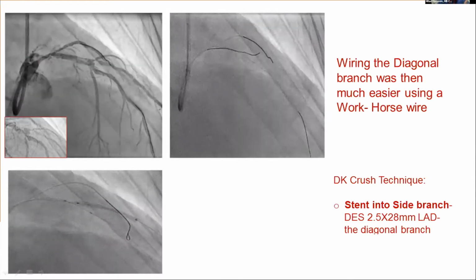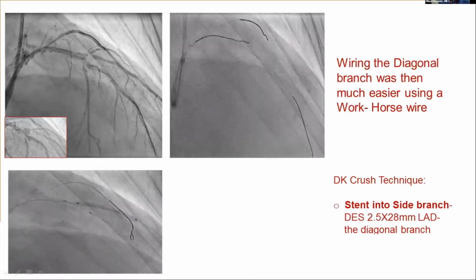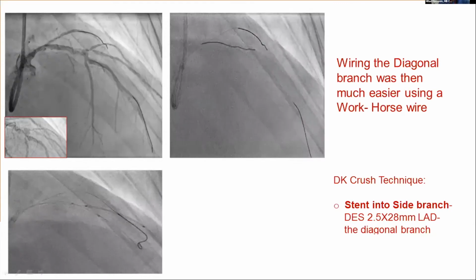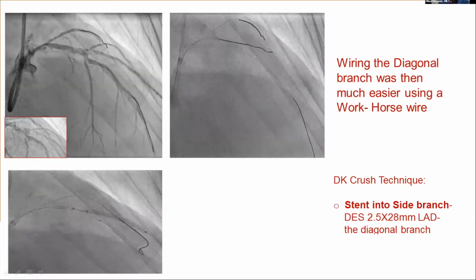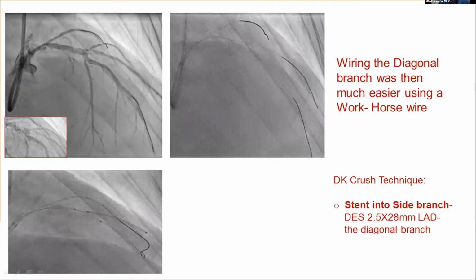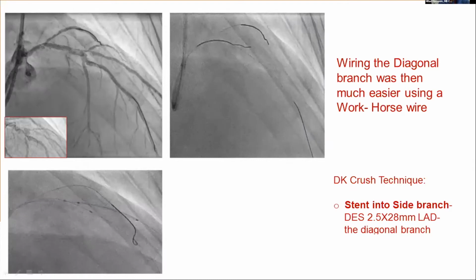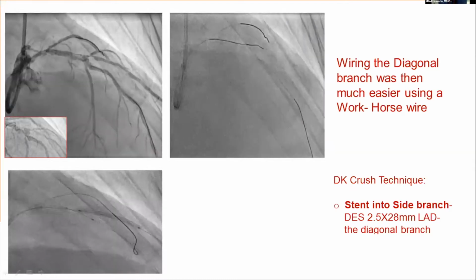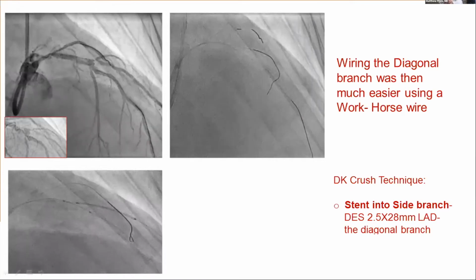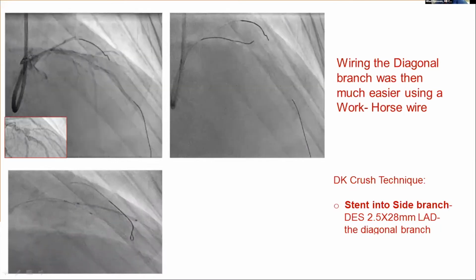But when the patient is uncomfortable and keeps moving, we are under time pressure to achieve stenting, so we relied on our visual assessment for sizing in this case. As you know, our modern stents are quite flexible. The IVUS, as I will show later on, was on the table. Okay, you can continue.